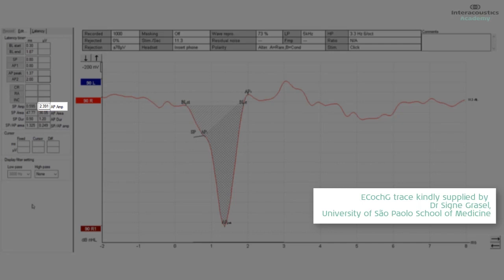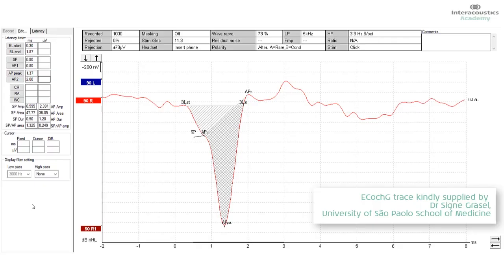For the AP amplitude, that measurement is from AP 1 to AP peak, which is the N1 peak. And so we're measuring the leading edge of the whole nerve action potential, or compound action potential, and the onset of that to the peak represents the amplitude of the AP.